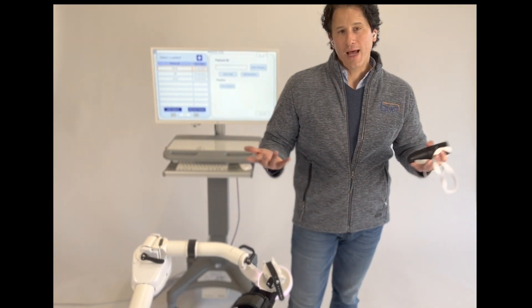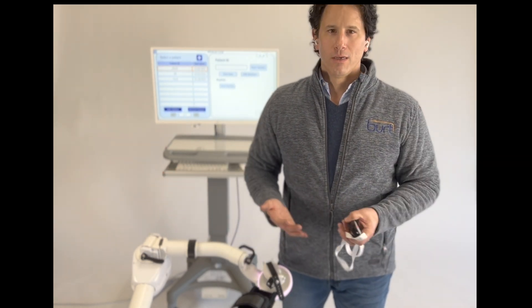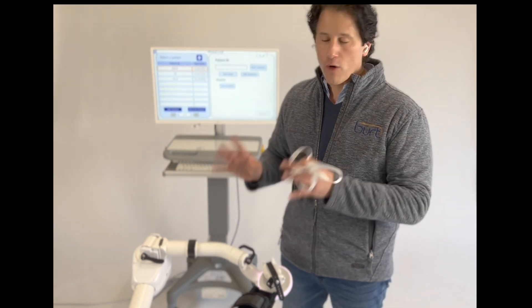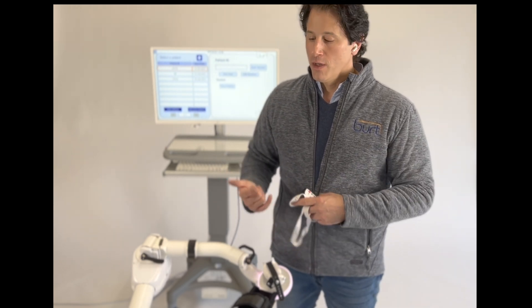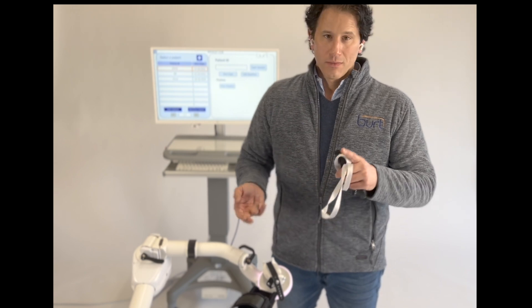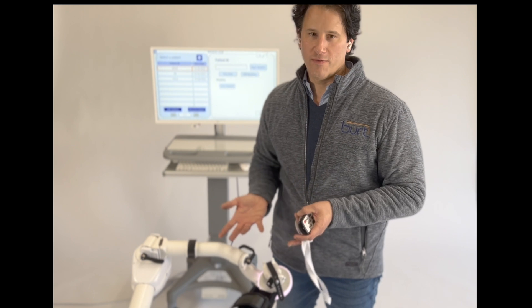The Shirley Ryan Ability Lab in the 2000s bought one of our commercial arms, and what they were doing was programming it to do therapy. That was very interesting to us. So in conjunction with them and with Spalding, and many years later, Burt was developed.